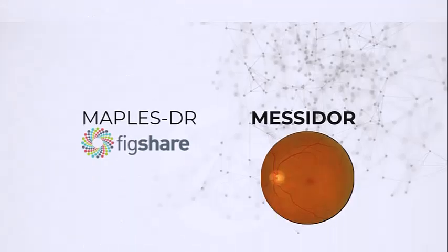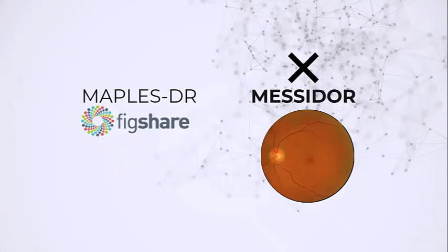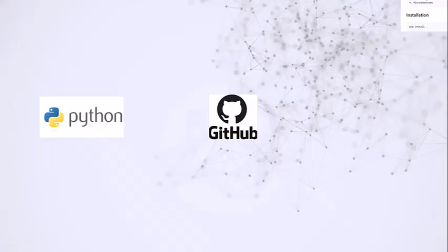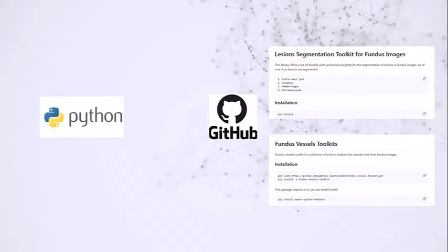However, this dataset does not include the fundus images from the Messidor, and they must be downloaded separately. MAPLES-DR dataset provides a Python package to load, export and preprocess the fundus images with their annotations from Messidor dataset. It provides 2 GitHub repositories to perform automatic segmentation of the retinal vasculature and retinal lesions.